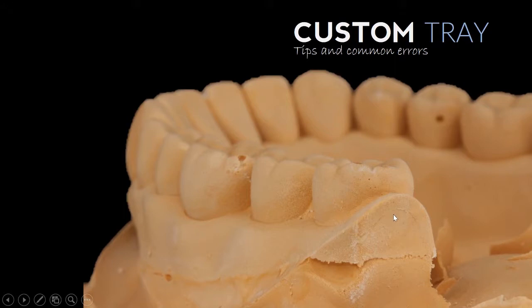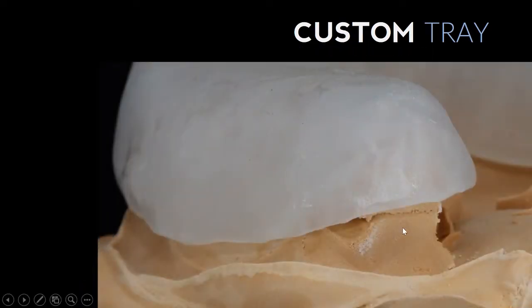In this area here, we have the maxillary tuberosity, and the tuberosity isn't fully captured in this impression. So if you were to make a custom tray that fits over and beyond that maxillary tuberosity.